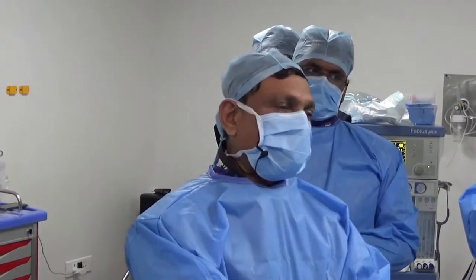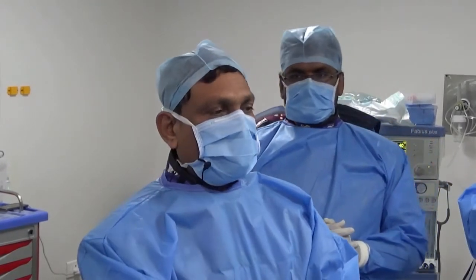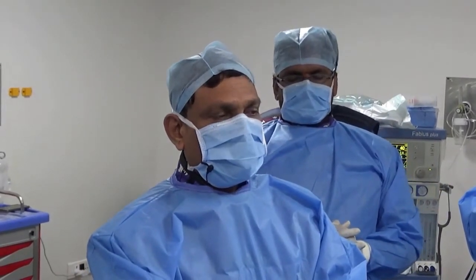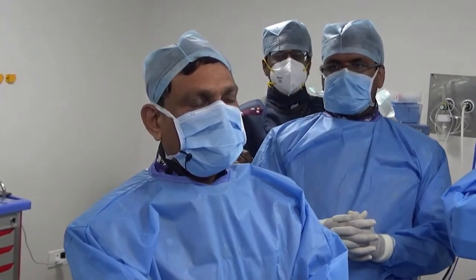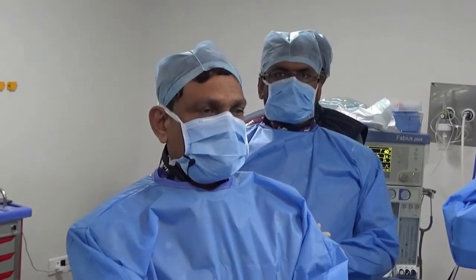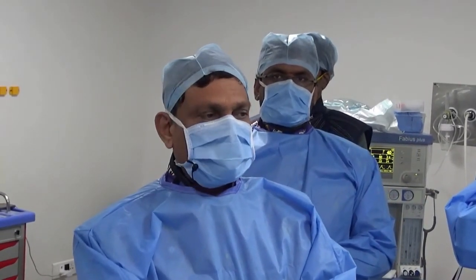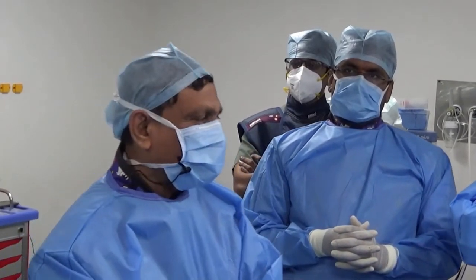I will tell my viewpoint on why I want to do it from the arterial side. On the venous side, I want to put a disc and pull as much as possible close to the coronary fistula. I don't want to occlude the coronary sinus totally. I want to leave a little bit of space so that the coronary venous flow can drain, even though people say it's not an important aspect.